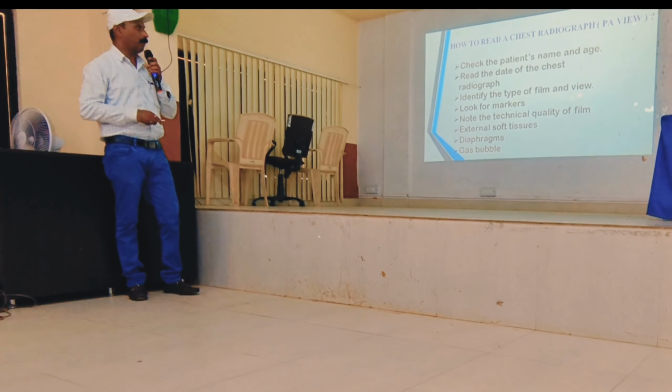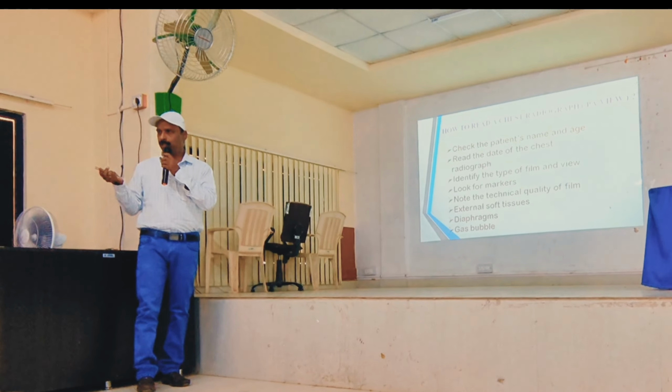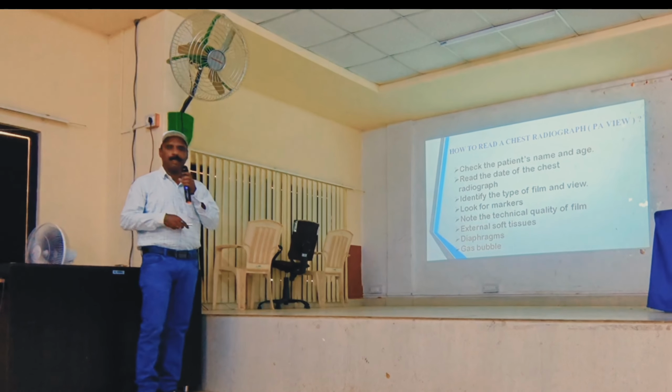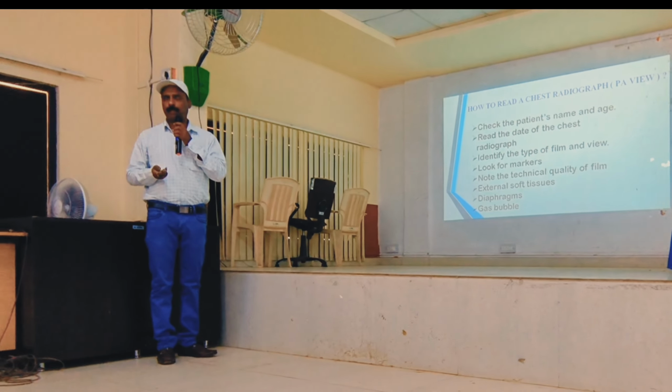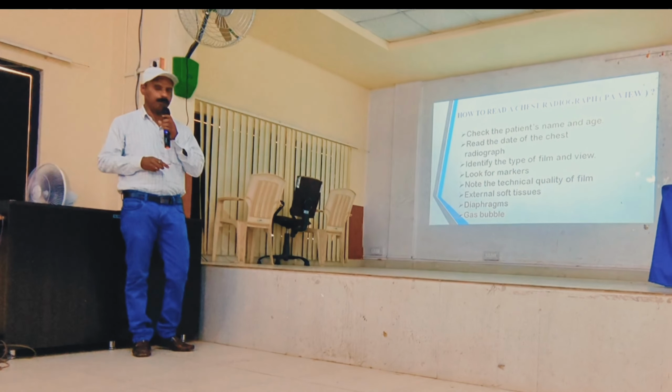Next, identify the type of film which is used. Now we can use paper film or digital, whichever it is, but we don't have all the medical waste like that we are finding now. It is printed on the film, with A4 size paper also.